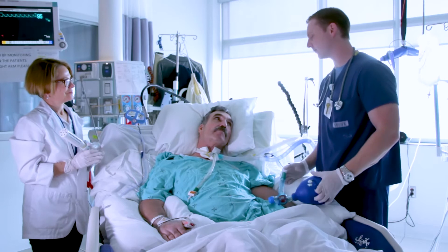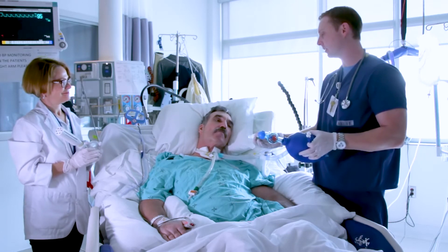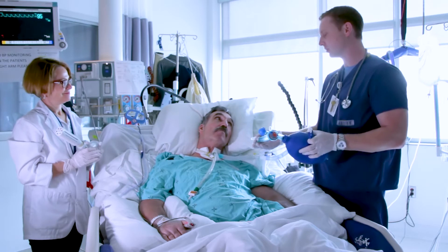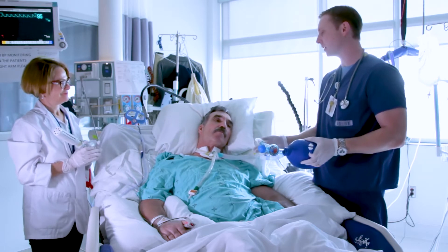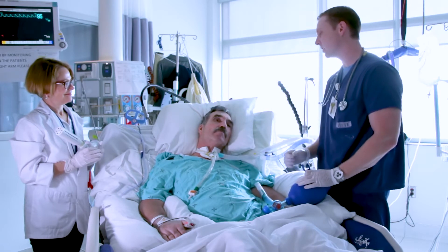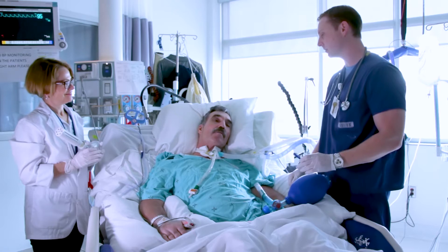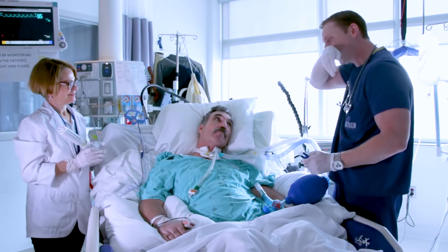Okay, Greg, next we're going to measure your peak cough flow. So what I'm going to do is the same thing with the LVRs — we're going to inflate your lungs with the bag. When we're finished inflating your lungs, we're going to place the mask on your face and you're going to blow out, and we're going to measure how fast you're exhaling. I'm going to disconnect you from the ventilator again.